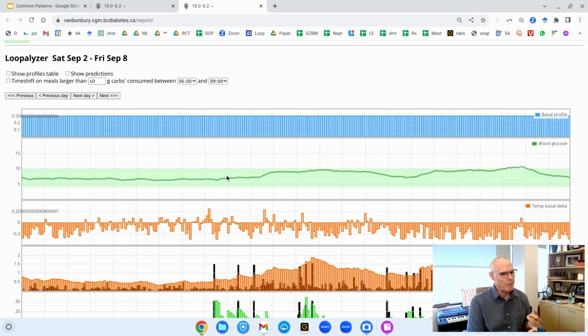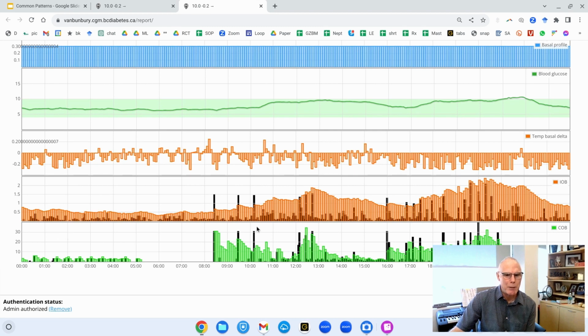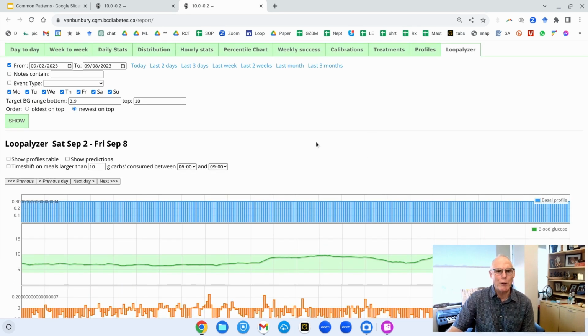They know how to troubleshoot. They can answer any question quickly, and what's more, they've got time. We have a half-hour appointment where they can help our clients. The endocrinologists ultimately make the treatment decisions, but we use their help. I know that our diabetes technologists like to look at insulin on board. If you're having lows and your IOB is negative, it typically means you need to lower your basal rate. That's one take home you might get from Loopalizer.